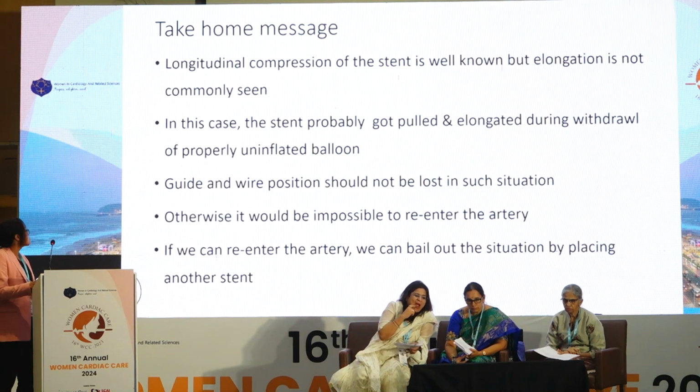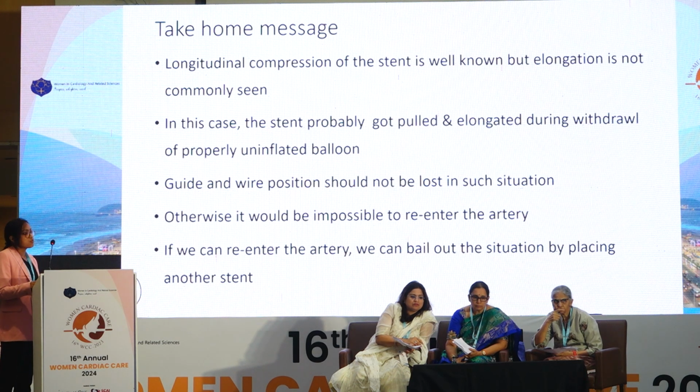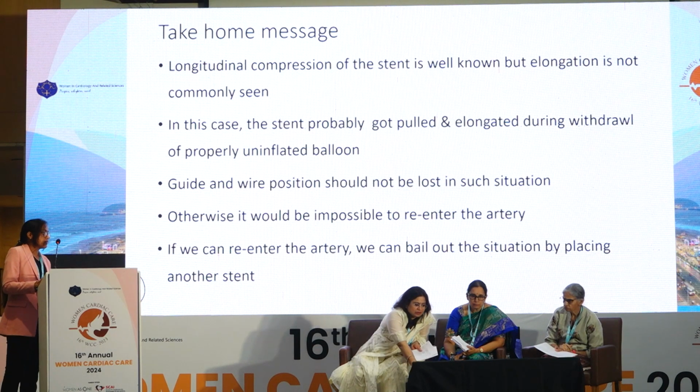So the take-home messages are: longitudinal compression of the stent is well known, but elongation is not commonly seen. In our case, probably the stent got pulled and elongated during the withdrawal of an improperly deflated balloon. Guide and wire position should not be lost in such a situation. Otherwise, we won't be able to re-enter the artery. And once we can re-enter the artery, we can bail out the situation by placing another stent and optimizing the result. Thank you.